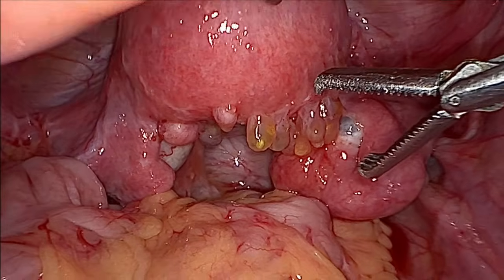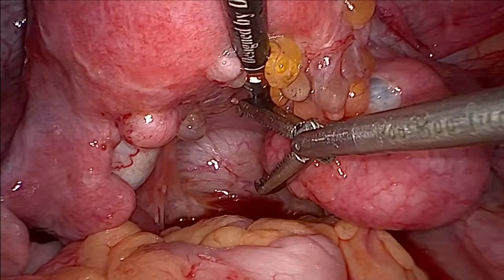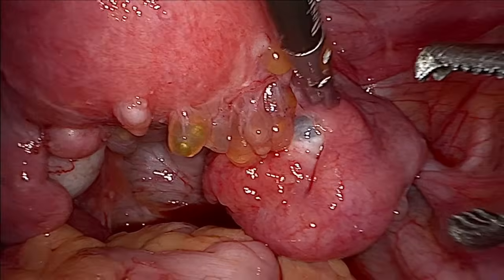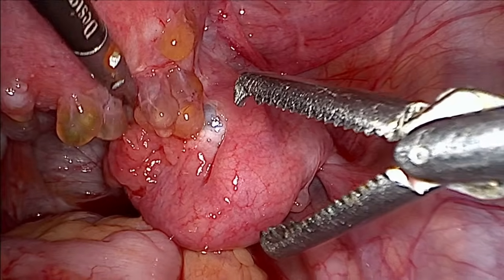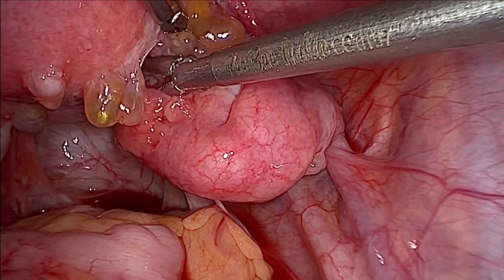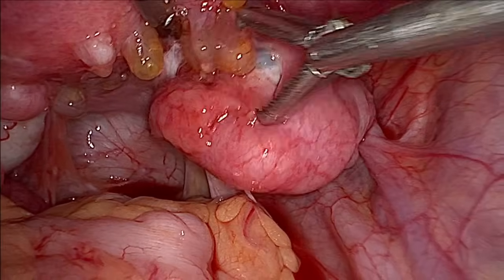You can see she is a patient with dysmenorrhea since 1 to 2 years. She is a young patient. You can see the right tube. The right tube is kinked here and it is attached to the uterus. We will try to separate it, and I think we won't be requiring a salpingectomy here.